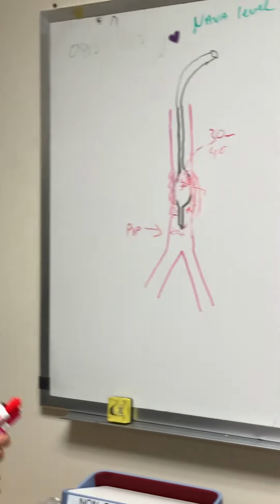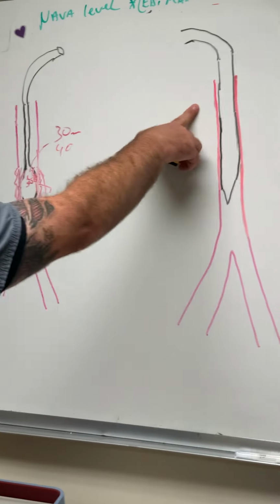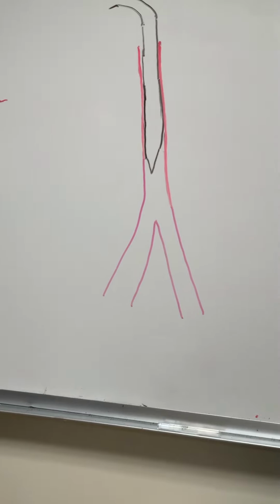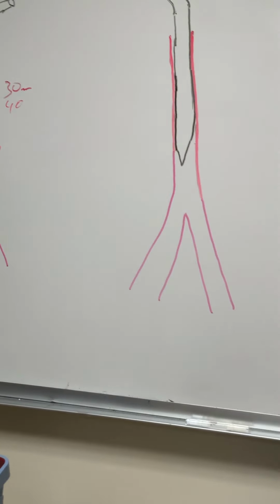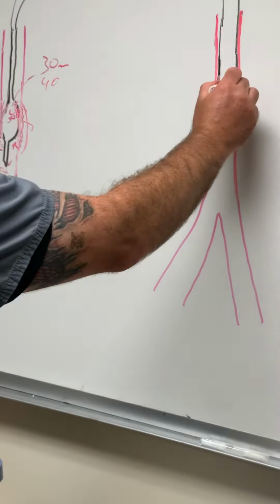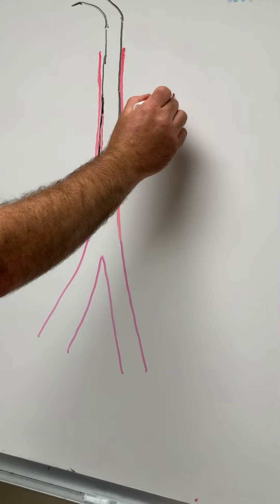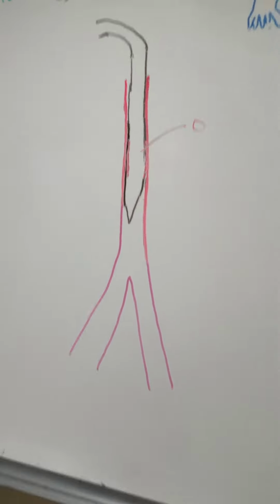Okay, so that's how we do our cuffs. Now, let's say we go over to this airway, right? What's happening here is this is a cuffed endotracheal tube in the trachea as well, but the cuff is all the way deflated. So here's your cuff, we measure it and the pressure is 0. So we have 0 pressure in our cuff.